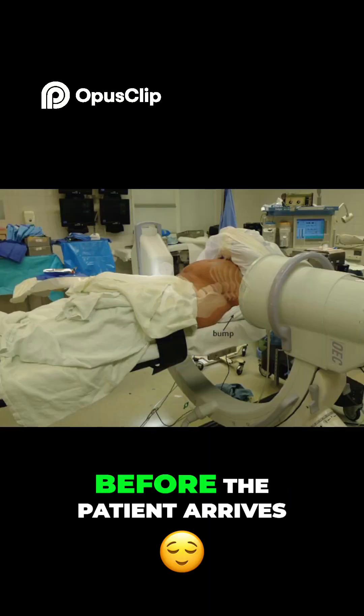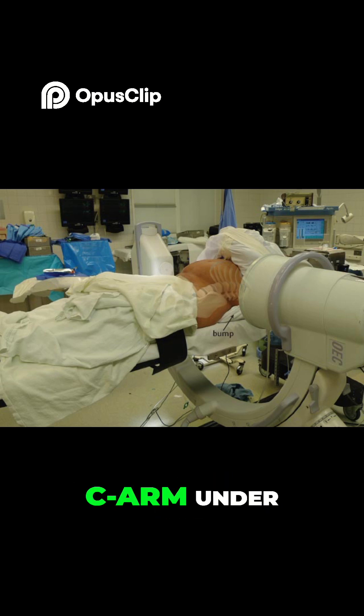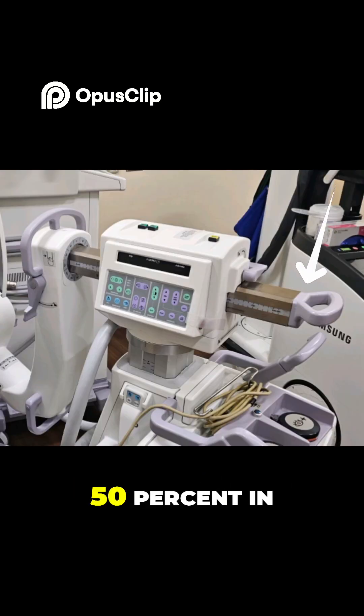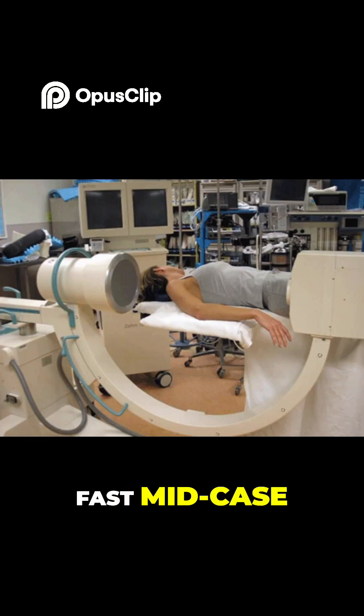Tip 3: Prep like a pro. Before the patient arrives, check the table setup — can you swing the C-arm under? Move IV poles and warmers out of your way. Park the C-arm telescoped 50% in so you can adjust fast mid-case without having to move the entire base.